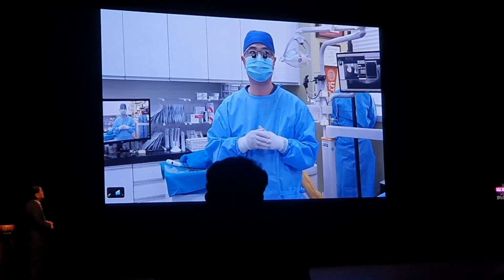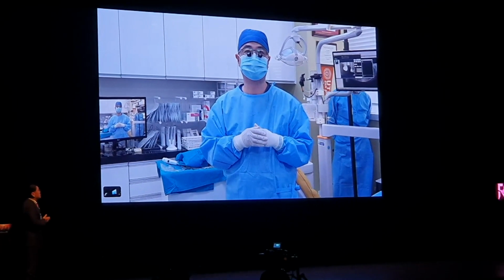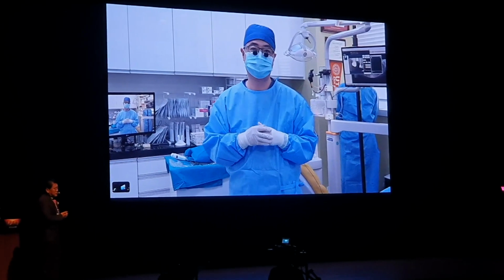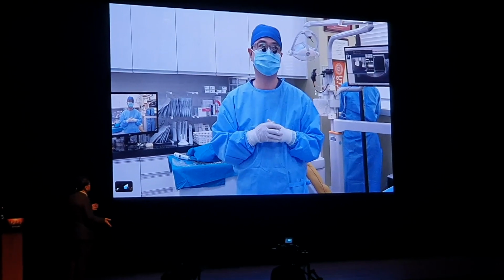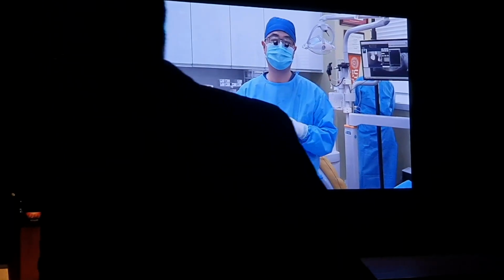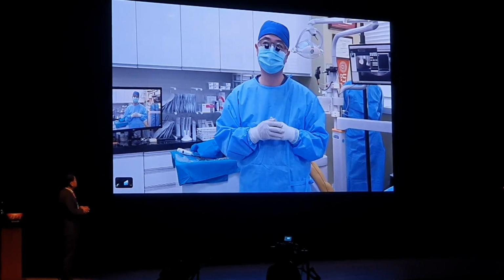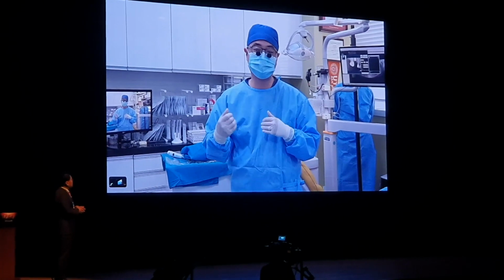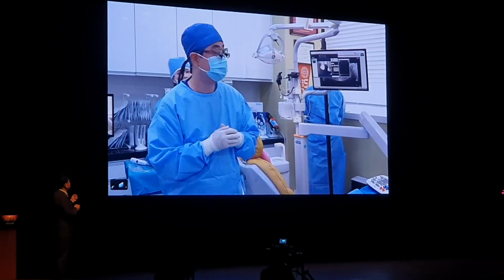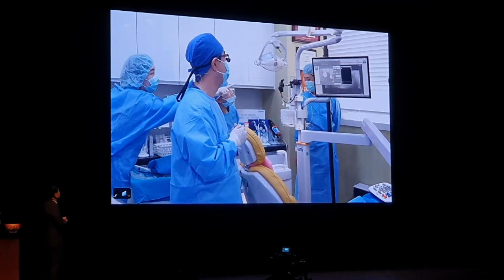The time starting from the pre-guide indexing has now passed 41 minutes and 50 seconds. Now 42 minutes. The remaining time for live surgery is about 1 minute and 15 seconds. Then I will show you the panoramic radiograph and record the rest of the surgery. Perhaps make it available later on. Is the panoramic radiograph out yet? We would like to see the healing abutment be connected. Alright, I'll do that.